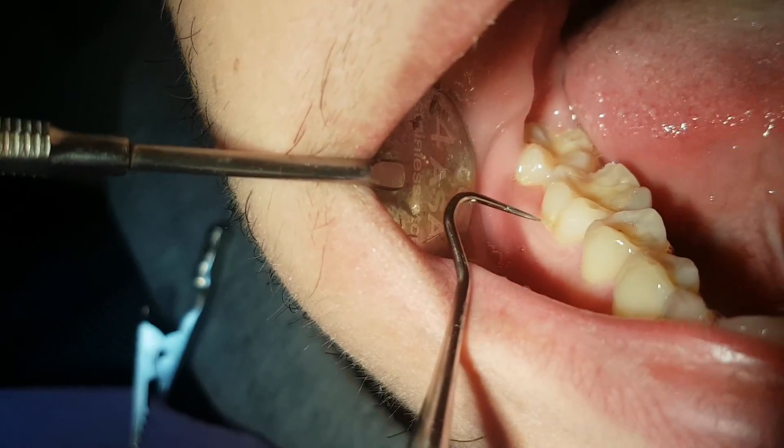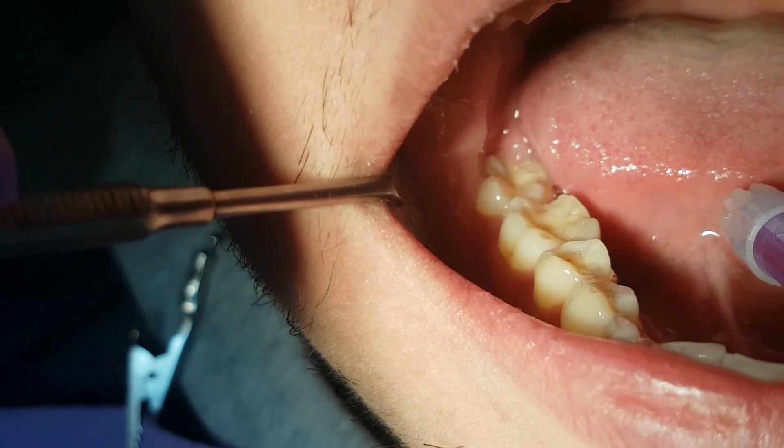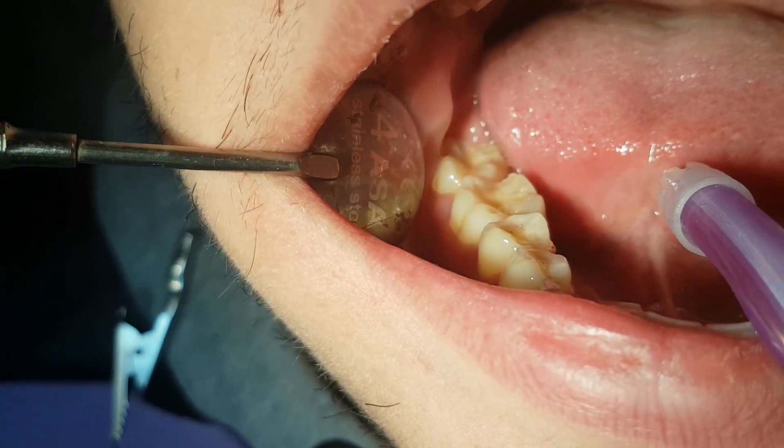This is the dental cavity we will work on. Using a dental mirror and a dental explorer, we diagnose the cavity.